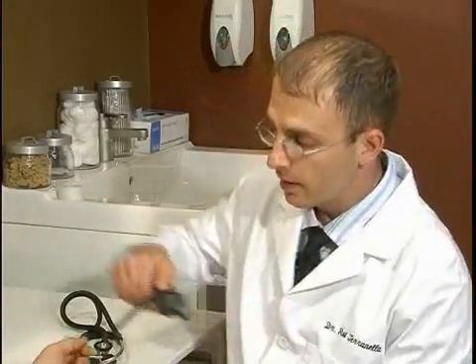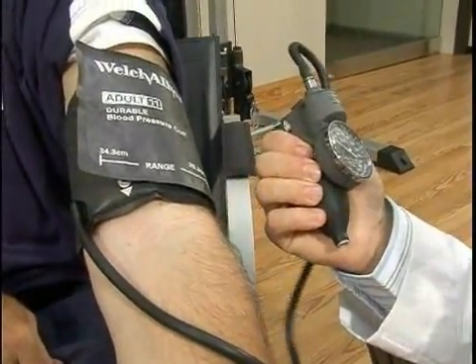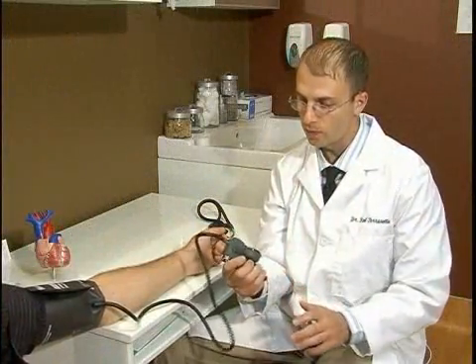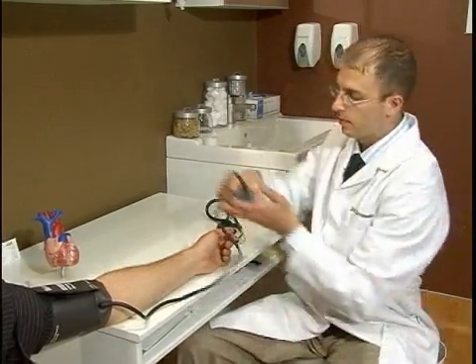Okay, so now we want to inflate the cuff. An important part of this is making sure that the dial on the blood pressure cuff is tightened all the way up so that when we pump the air through this, it's going up into the cuff and not out the side.